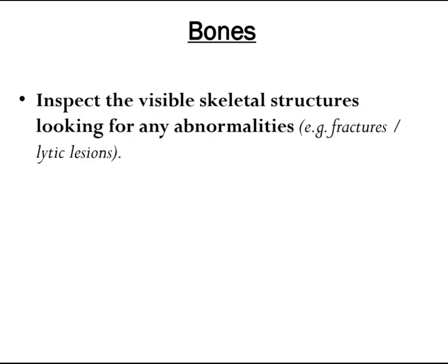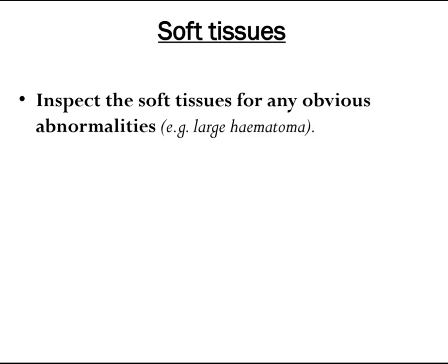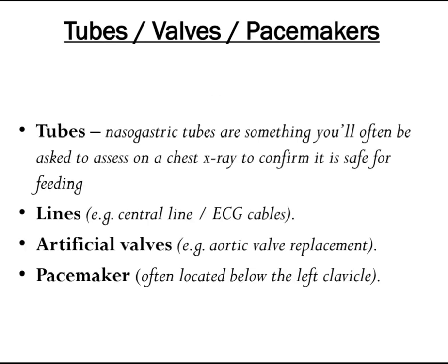Inspect the visible skeletal structures for any abnormalities such as fractures or lytic lesions. Inspect the soft tissues for any obvious abnormalities such as a large hematoma. Also assess for tubes and devices: nasogastric tubes are something you'll often be asked to assess to confirm it is safe for feeding. Also look for lines such as central lines, ECG cables, artificial valves such as aortic valve replacements, and pacemakers, which are often located below the left clavicle. That's all about how to read a chest x-ray — thank you.